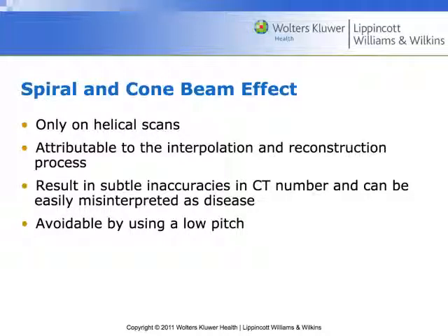Spiral and cone beam effects. This is not related to cone beam CT that they do in radiation therapy. This is related specifically to diagnostic CT. So as they use that word cone beam, just be aware that I'm talking about it from a diagnostic point of view. This is only for helical scans because it will use a fan or a cone beam for helical scanning, and it has to do with interpolation or the reconstruction process. It doesn't have enough information, so it's putting other junk in there.